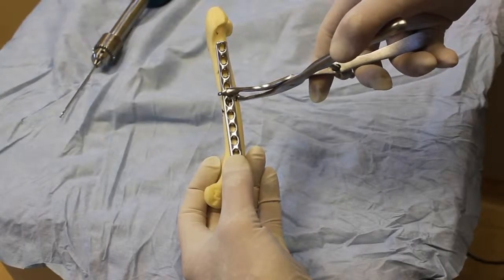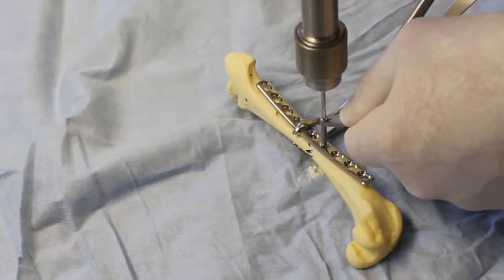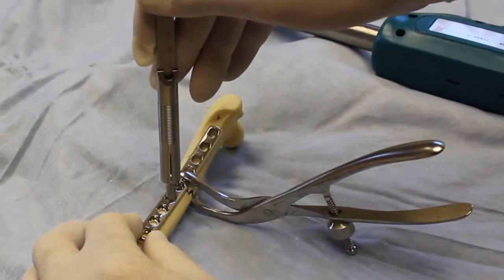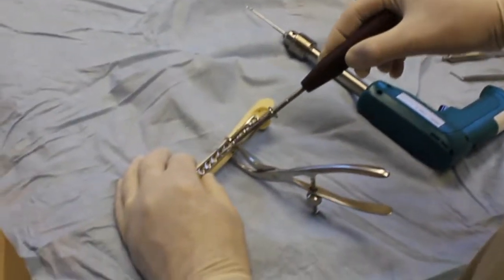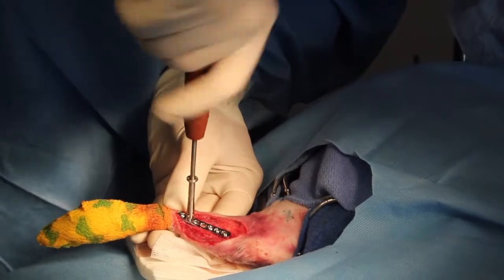Next, the plate is held to the bone with special forceps, and the first screw hole is drilled. Then, a depth gauge is used to determine screw length, and the self-tapping screw is inserted.